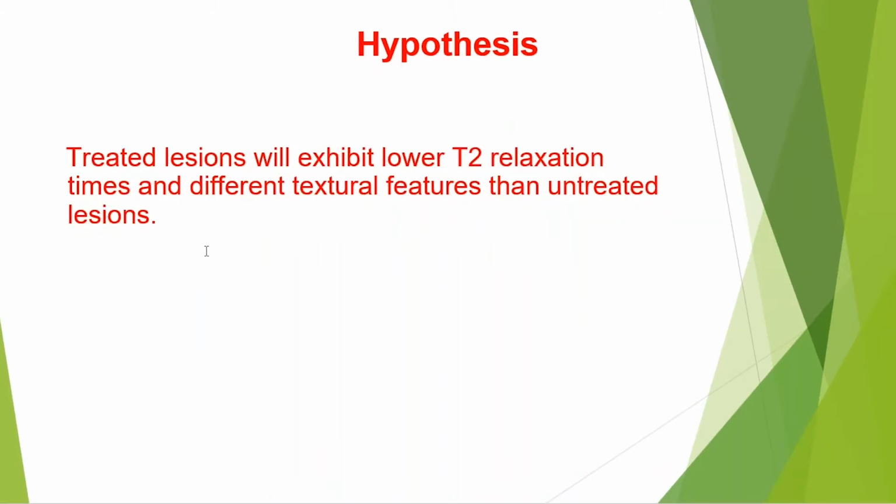Our hypothesis was centered on treated lesions exhibiting a lower T2 relaxation time and displaying different textural features after treatment than prior to treatment.